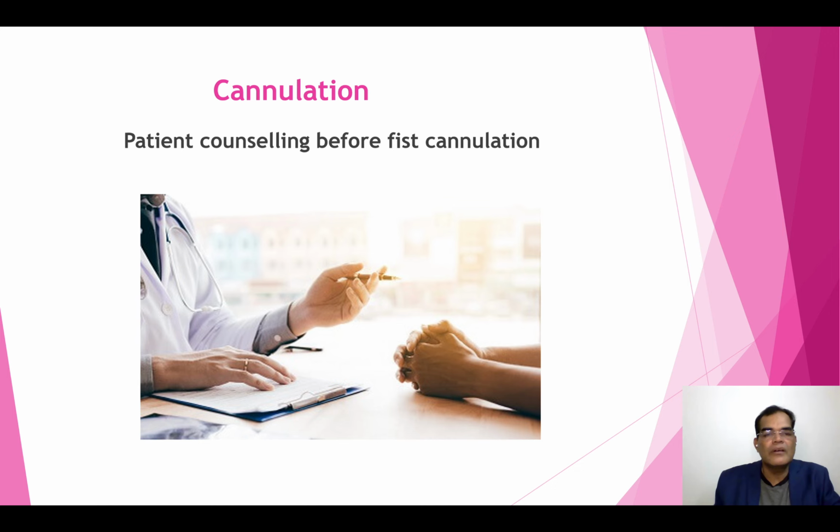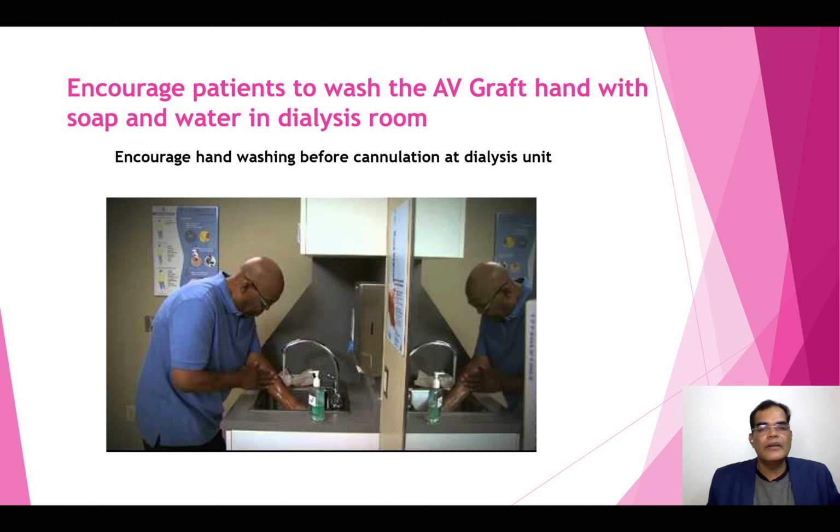Before cannulation, we need to do good counseling of the patient: explain why we are doing this, what the pain possibilities are, how we needle, and what care needs to be taken after the removal of needle. All of this needs to be explained to the patient before cannulation. And once they arrive at the dialysis center, it is better to encourage them to wash the hand, because they must have been traveling outside. There will be a lot of dust and heat or sweat on the street clothes. So it's better to wash in the dialysis unit with simple soap and water.